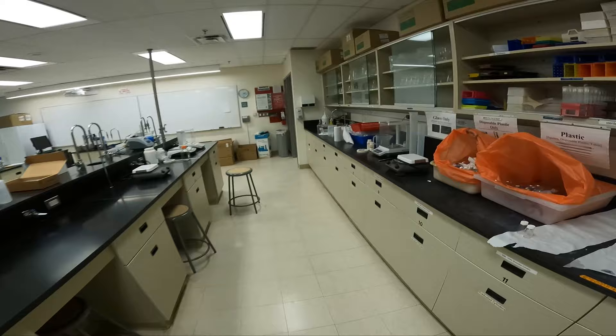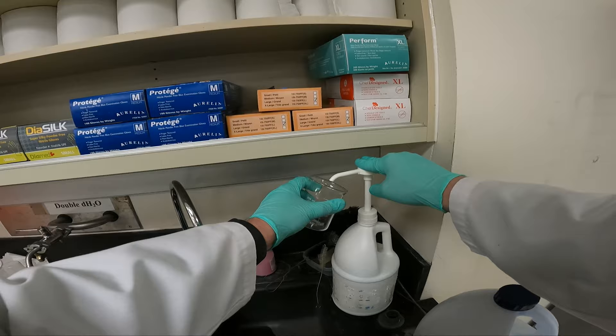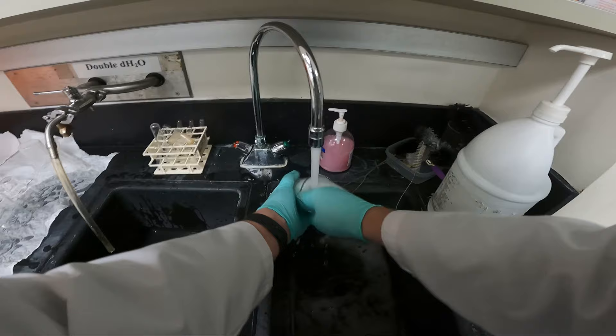In a previous lab, we made up PBS. We will be making a PBS EDTA solution first, and then we'll dissolve the trypsin in the solution of PBS and EDTA. First, let's wash our glassware.